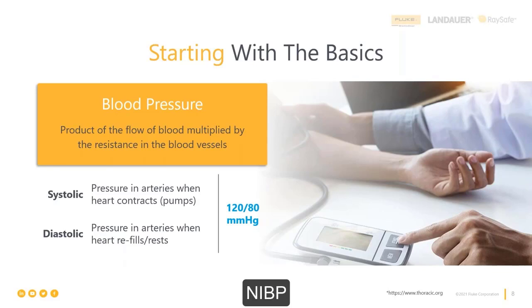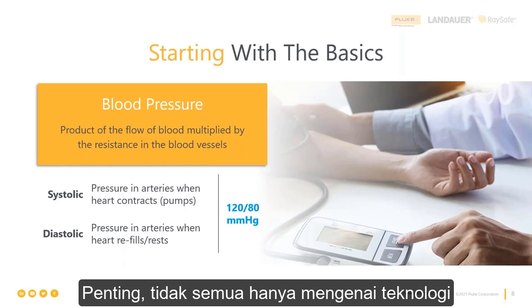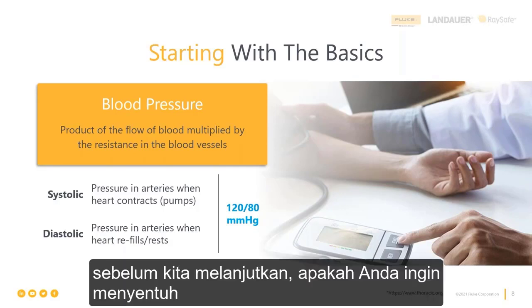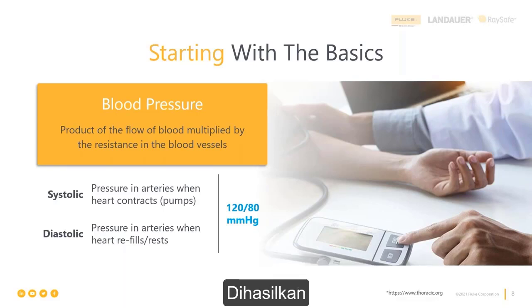So just make sure that you have that straight in your head when you're thinking about NIBP. The clinical part of this is really important. It's not all just technology. It's a technology that we use in order to obtain this measurement. Okay, go ahead, Mike. Before we move on, do you want to touch quickly on how blood pressure is generated?